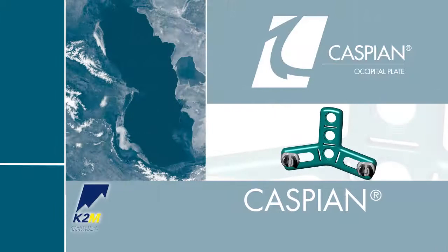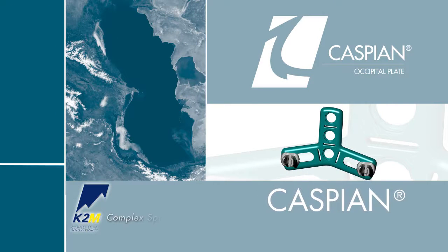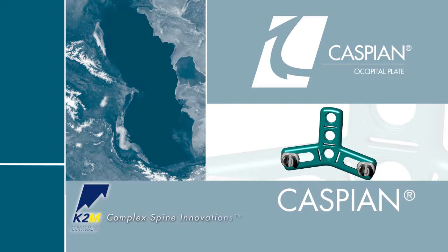Introducing the Caspian Occipital Plate System from K2M, Complex Spine Innovations.